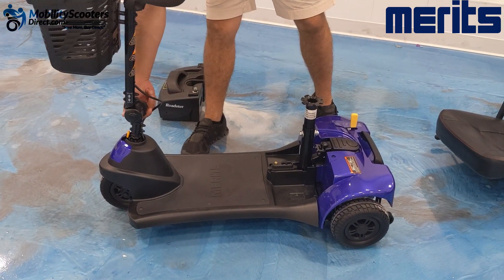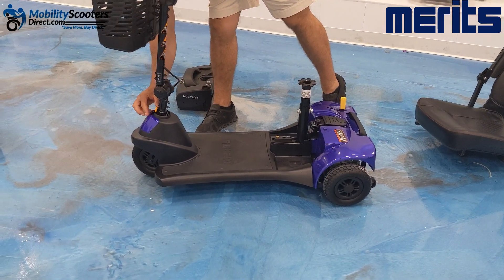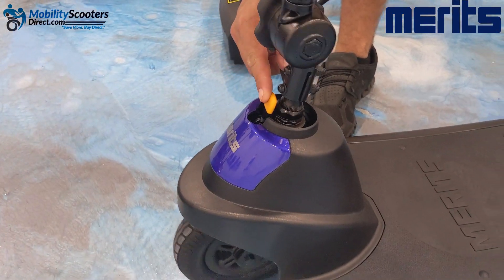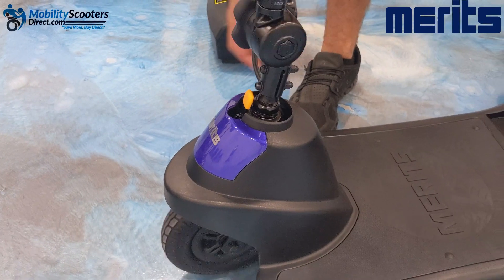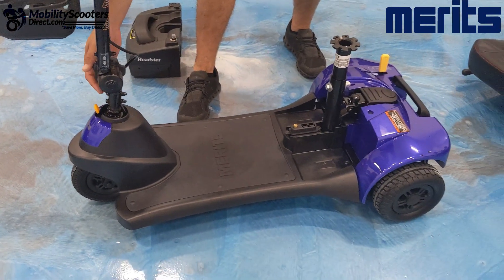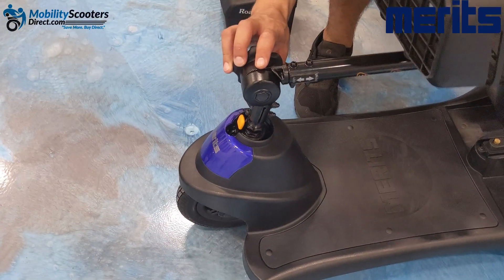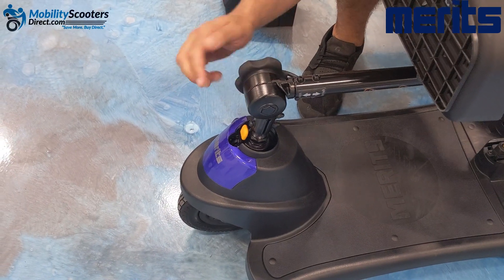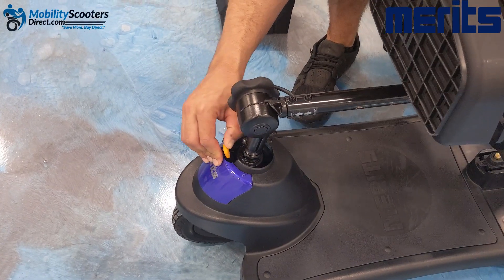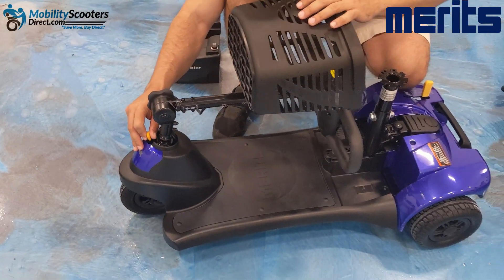To prevent the handlebar from swinging around uncontrollably, there's a yellow lever on the front of the scooter. Engage that yellow lever to the forward position and it will lock your tiller handlebar, preventing you from being able to turn it at all. It's only meant to be engaged when transporting the scooter in the trunk of a car or cargo space of an SUV so the handlebar does not swing around uncontrollably while taking turns in your vehicle.